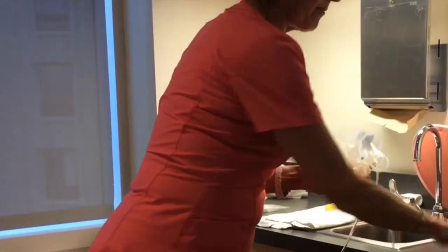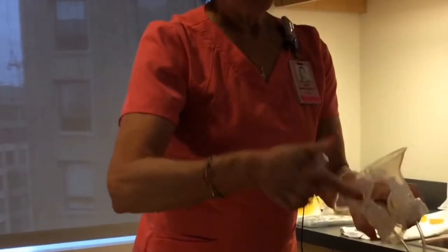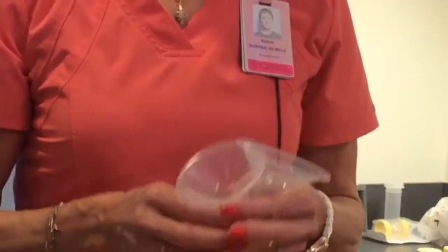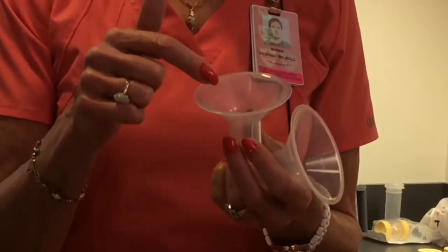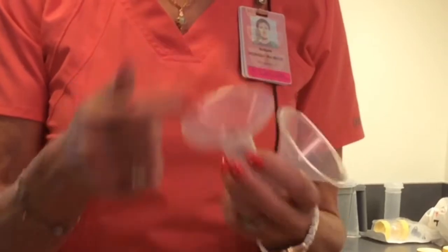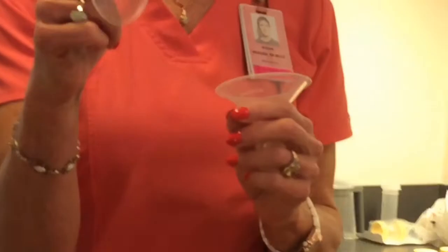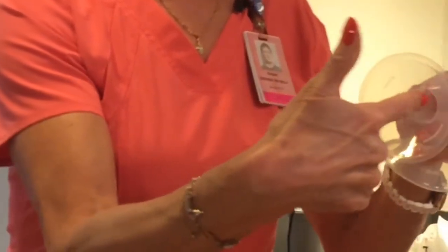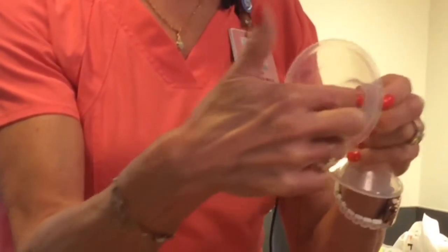We usually have moms apply a thin smear of lanolin right at the beginning of the tunnel to help decrease friction on the nipple. The size of the horn — or breast shield — is very important for comfort and efficiency of pumping. A shield that is too tight would be painful and cause trauma. You want the nipple moving freely in the tunnel without pinching or discomfort.